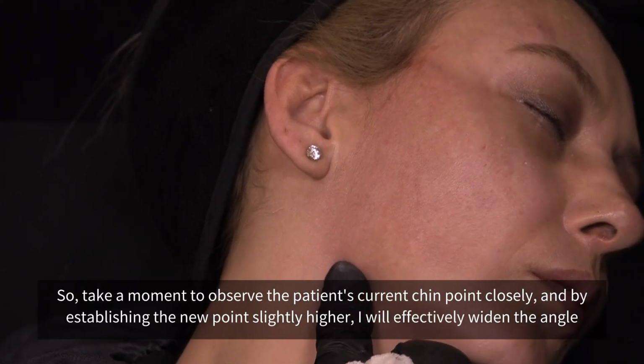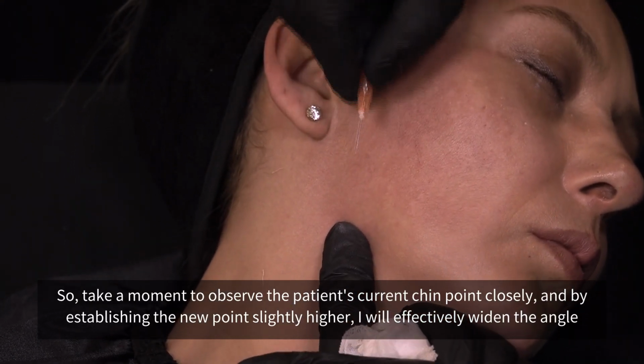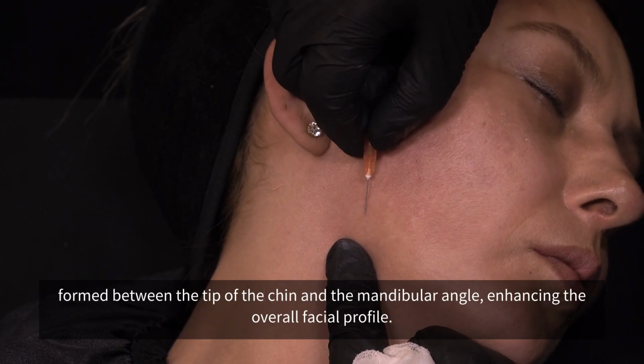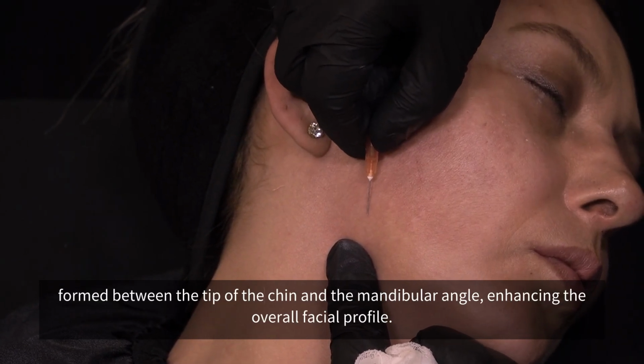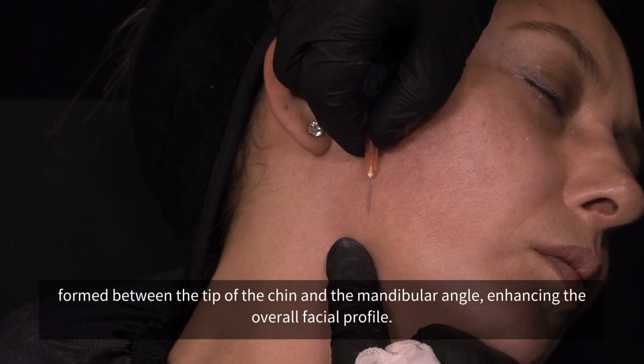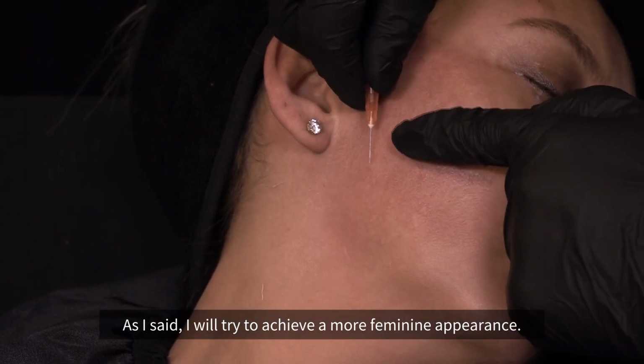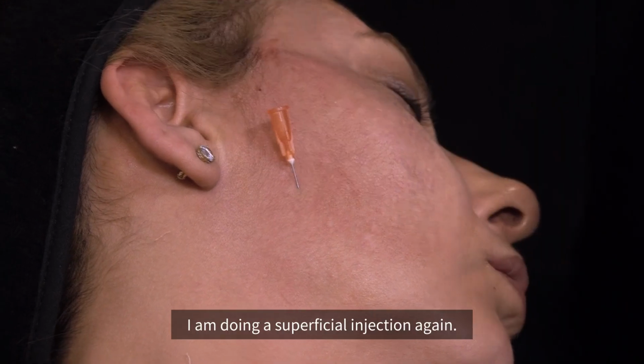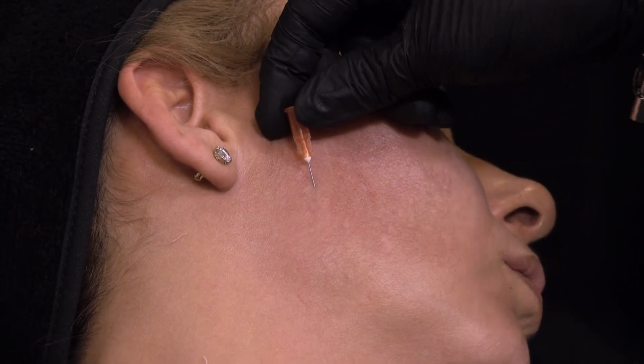So, take a moment to observe the patient's current chin point closely, and by establishing the new point slightly higher, I will effectively widen the angle formed between the tip of the chin and the mandibular angle, enhancing the overall facial profile. As I said, I will try to achieve a more feminine appearance. I am doing a superficial injection again.